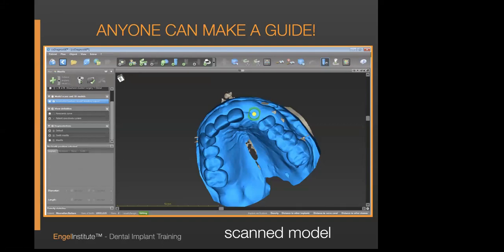So I talked to the patient and I said, listen, this is not ideal. We're gonna have one small tooth. We have to figure out which one we want. And then depending on what she decided, we'd make those teeth. I knew I was going to cantilever. My personal recommendation, this is just me and the way that I do things, the only way that you're going to figure out any failures is by keeping things consistent.